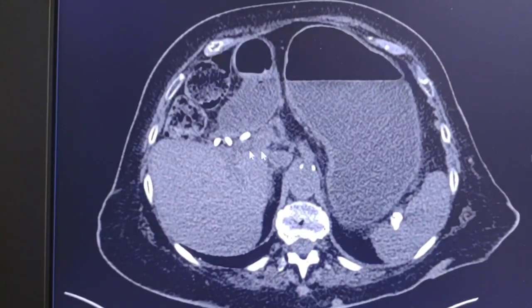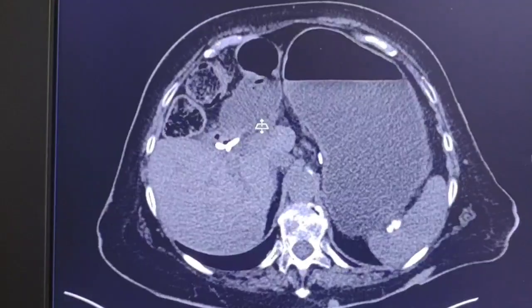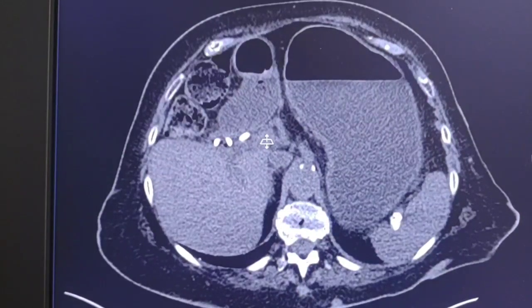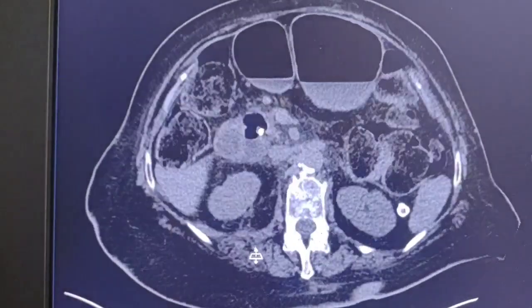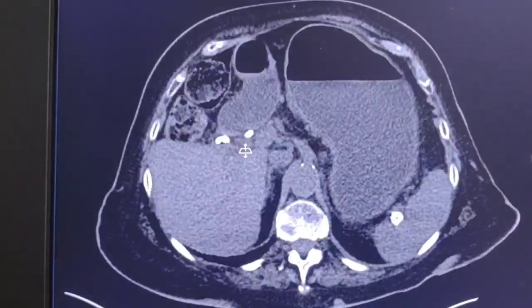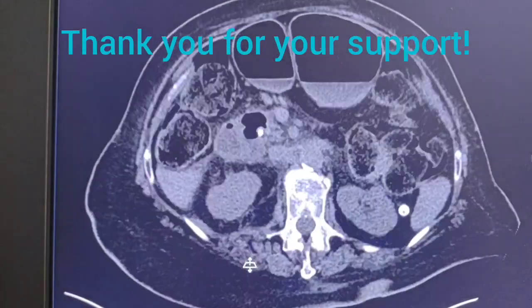So all these possible underlying pathologies should be under consideration when we report a complex case like this, particularly if there are multiple catheters or stents.